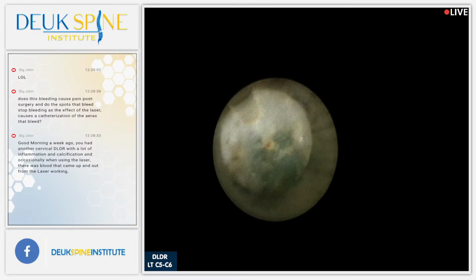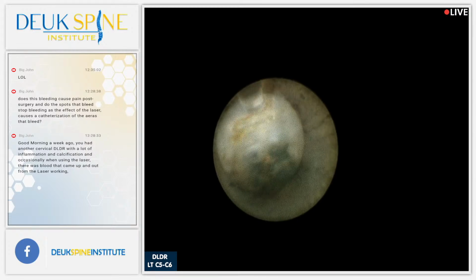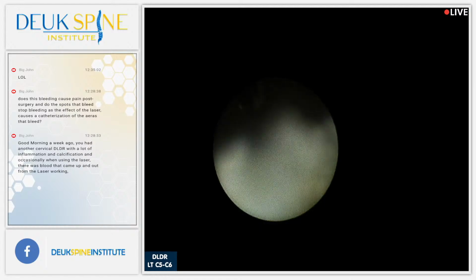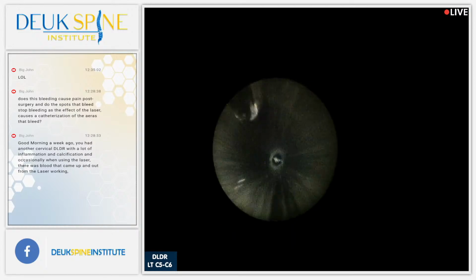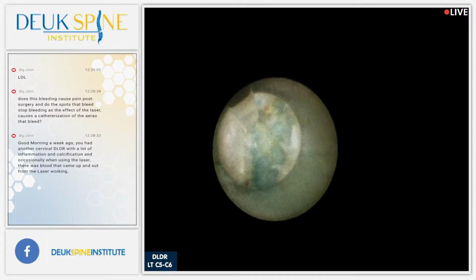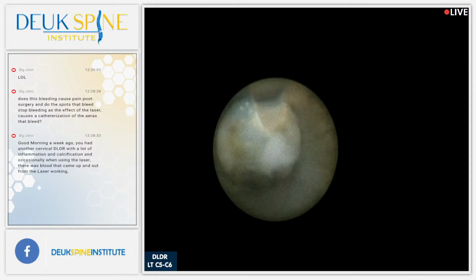So I tell people, if you have a disc problem like this, even if it's a small bulging disc, get it fixed with the laser surgery. That way you stop hurting and you don't get too much bone spurs, you don't get too much degenerative disc disease, you don't get too much radiculopathy, because the longer you wait, the more permanent things become.